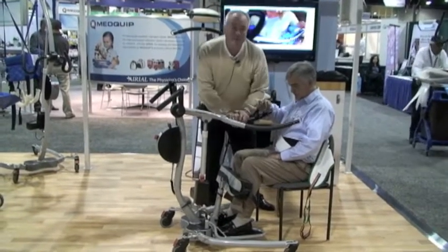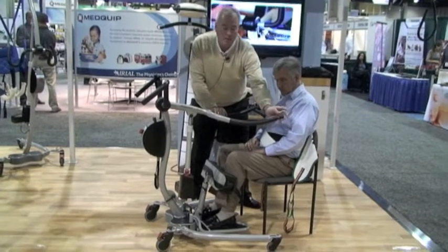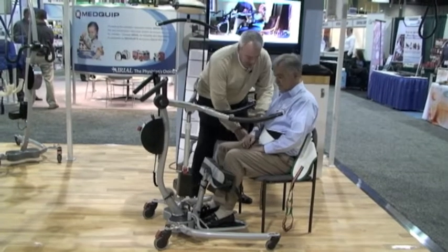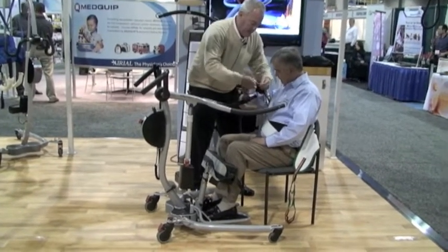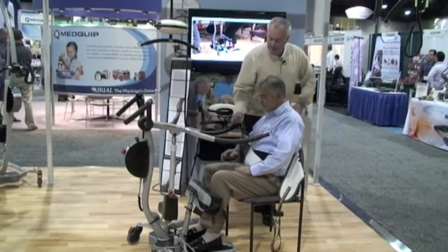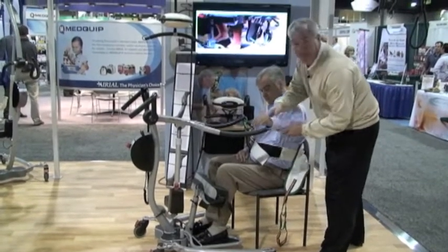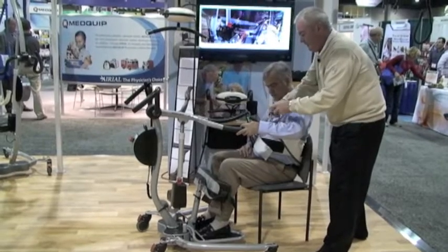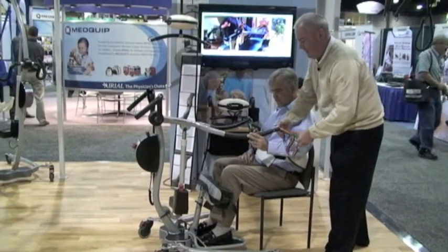One nice thing we have with Ergoette is our loop hooks here — they actually lock into place. I'm going to ask the patient, Tom, to keep his arms on the outside. I'll go ahead and put the loop on and make sure it locks, same thing on the other side. I'm going to ask the patient to put their arms on the outside, and you hear that little sound when it locks.